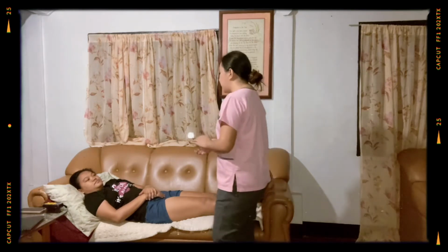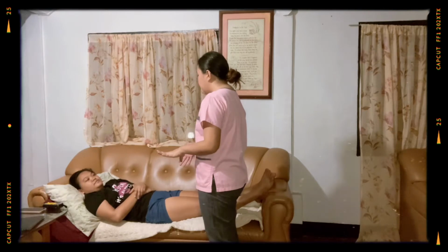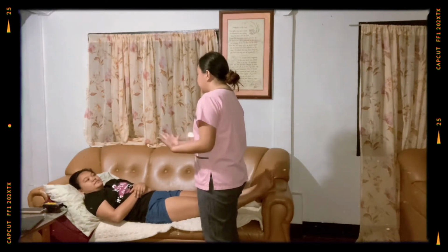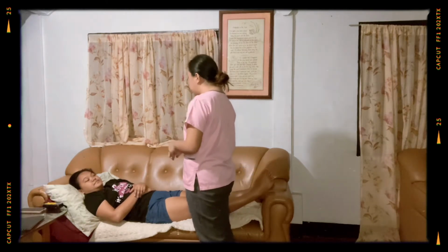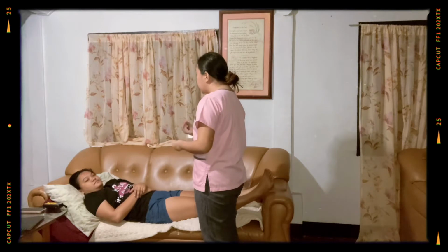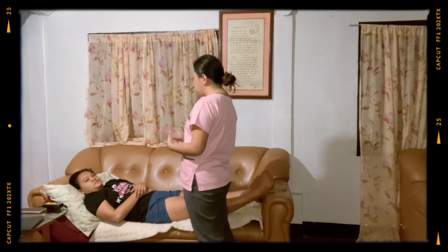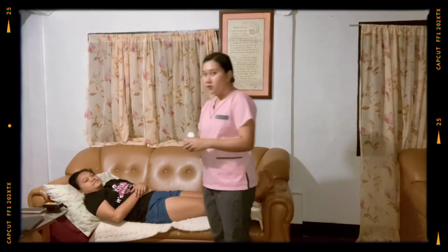So good day, ma'am. I am Myra Justin Bitinorian, your nurse for today. What's your name, ma'am? Andrea. What's your birthday, ma'am? September 10. Okay, ma'am. So for today, ma'am, we are going to do an exercise which is called ambulation. And we are going to use a walker. Do you have experience, ma'am? Yes, ma'am. So, since you have already experienced using a walker, I will just assist you, ma'am. Is that okay with you? Yes, ma'am.